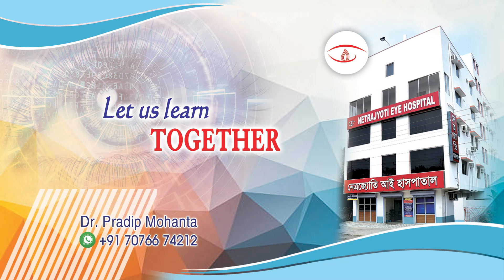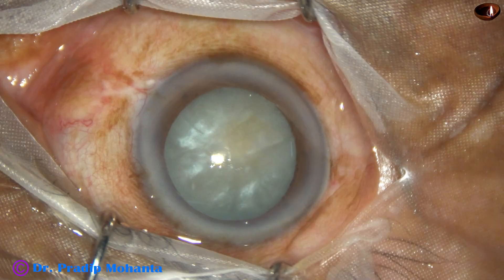Friends, welcome to my workplace at Ranakh Heart, West Bengal, India. This is an intumescent cataract. Let us observe this totally unedited surgery.